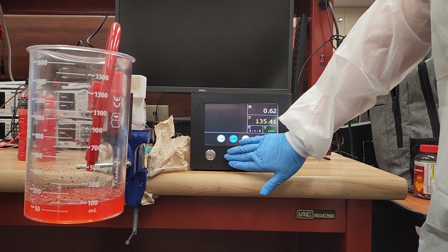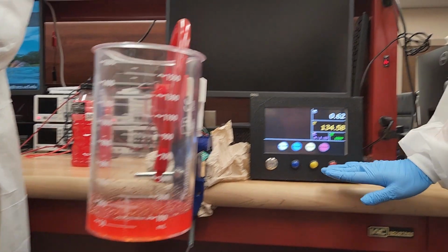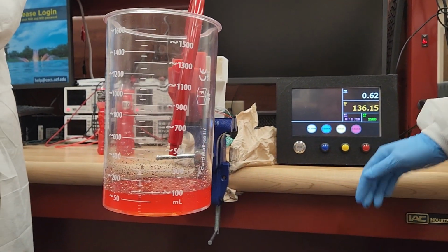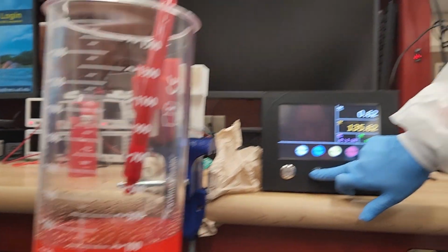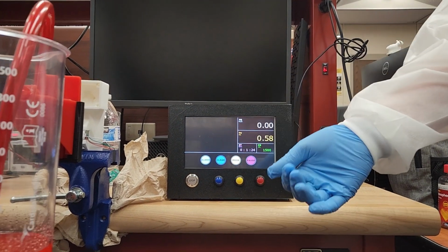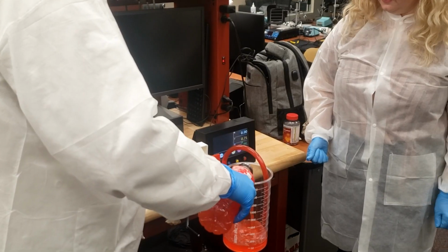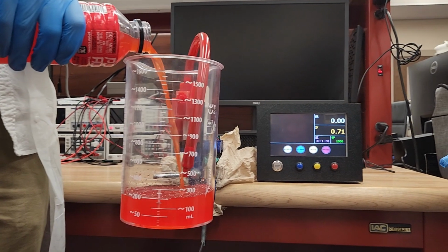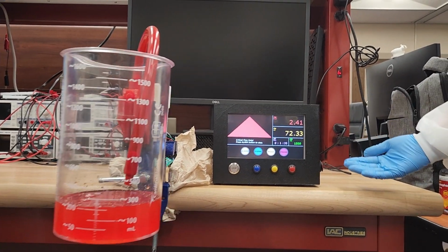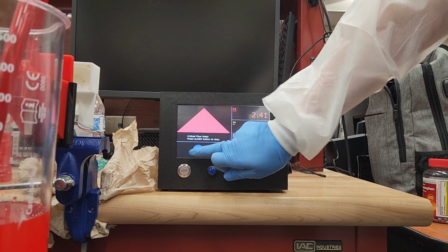Now I can press clear if I would like to clear the data that has been tracked so far, which we have 133 milliliters, which you can see matches our canister. And now I can clear, and we can add to our canister, and any additional blood loss will be tracked. Here you can see our alarm has alerted again, and I will disable the alarm by pressing the button.